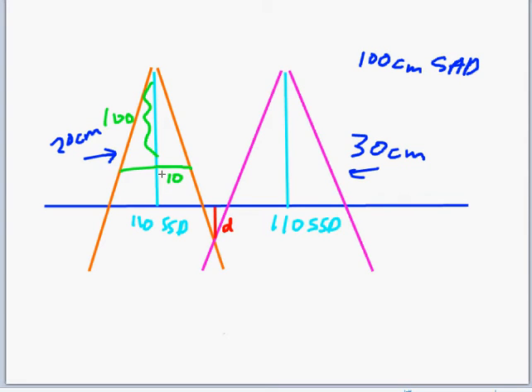And then we go further 10 centimeters down to the patient's surface. It's going to be a little bit longer field down at the patient. In fact, I think if you figured it out, you'd get 22 centimeters on the patient here. But our jaw setting is 20.